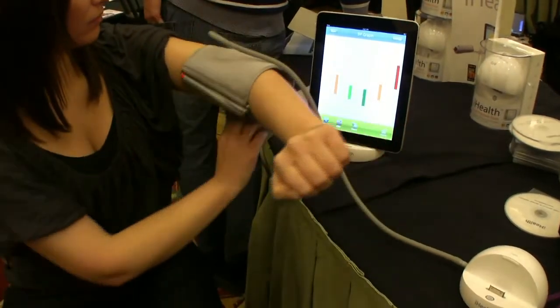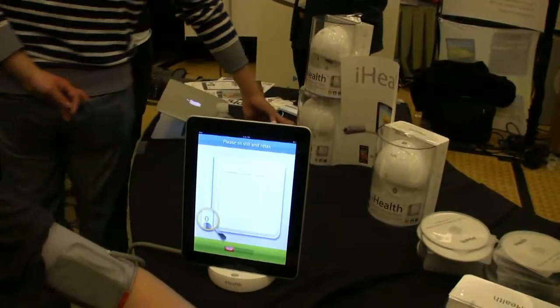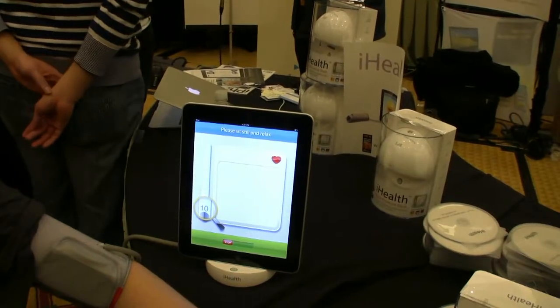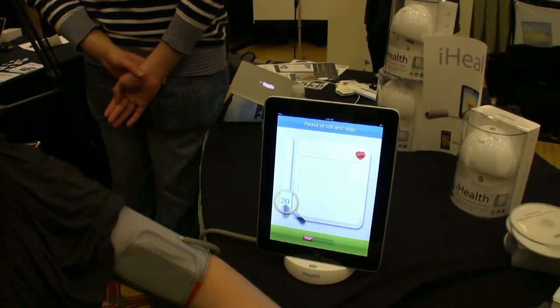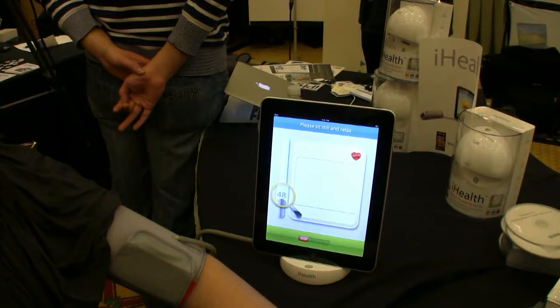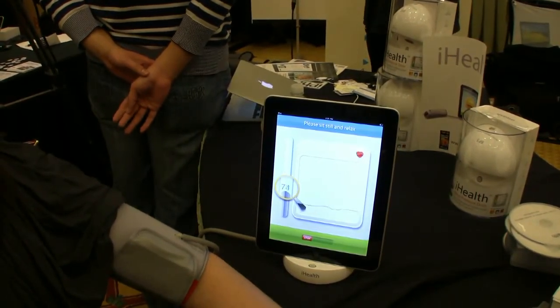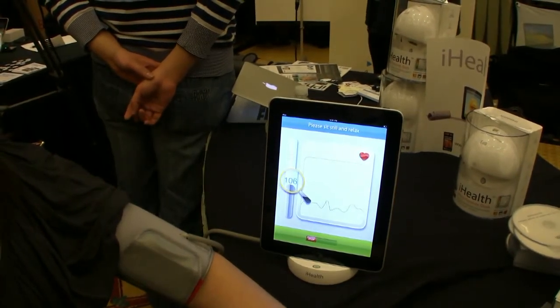It's really simple — you just press the start button and it's asking her to sit still and relax. Any wild movements, laughter, or talking would adversely affect her results. She's sitting still and right now it's pumping pressure to her arm and we're starting to get a reading on her heartbeat — looks very healthy.